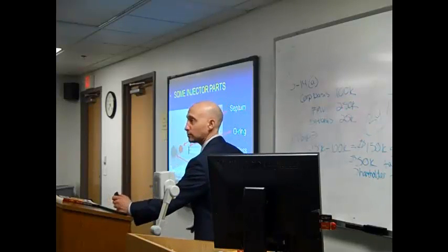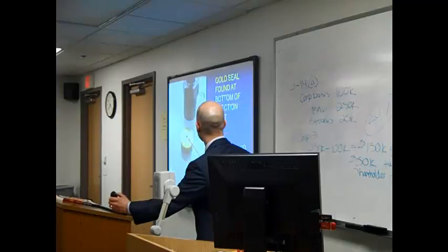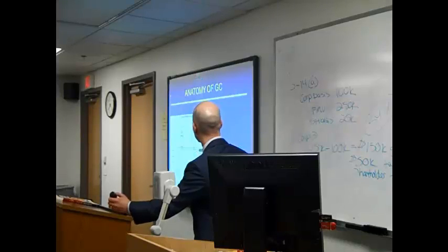Are they supposed to document when they do that so you can find out whether they did it properly? They sure are. And that's what you're asking for. How often are they maintaining, cleaning these components? The same with this gold seal, which is at the bottom of the injection.